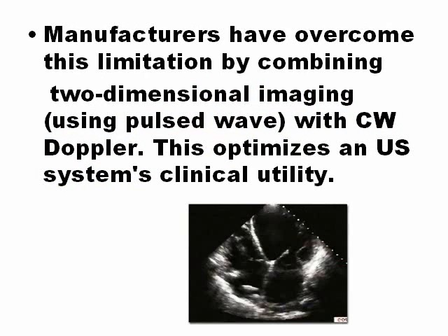But really, with new transducers, there is a combination of pulsed Doppler with continuous wave Doppler that can give you a picture, and you know how to measure, but they are not exactly the same as pulsed Doppler, because continuous wave Doppler doesn't measure one exact area, it measures all the line.